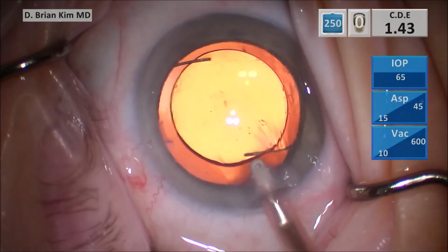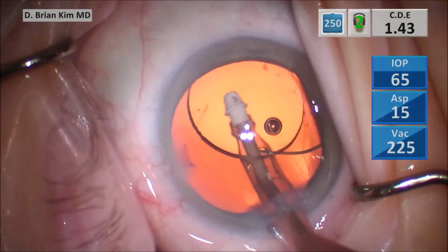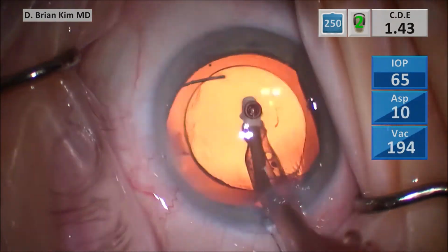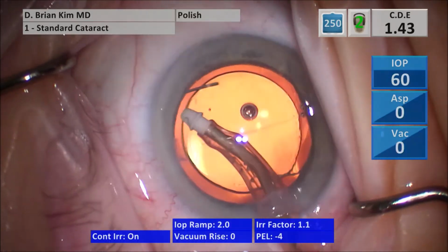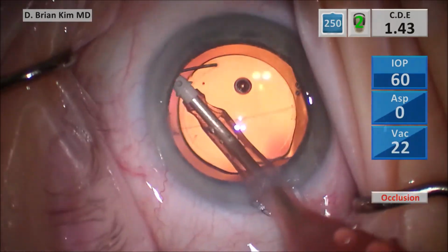So I go in, activate irrigation, go underneath the optic, removing the viscoelastic from within the bag. And then removing the viscoelastic from under the rhexis edge some more in the polish mode. And then I'll remove the viscoelastic from the anterior chamber and I'll hydrate my incision.